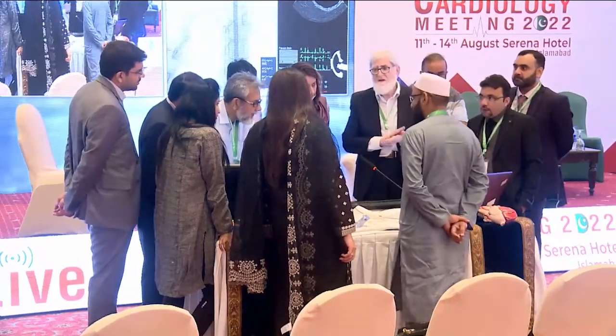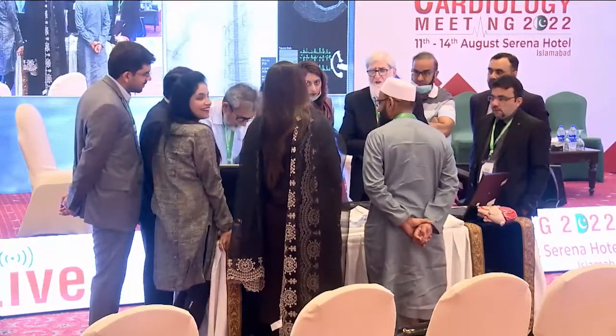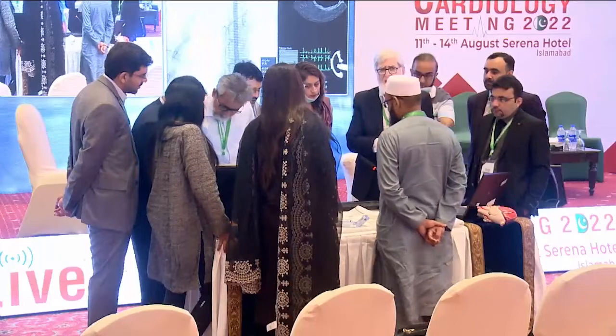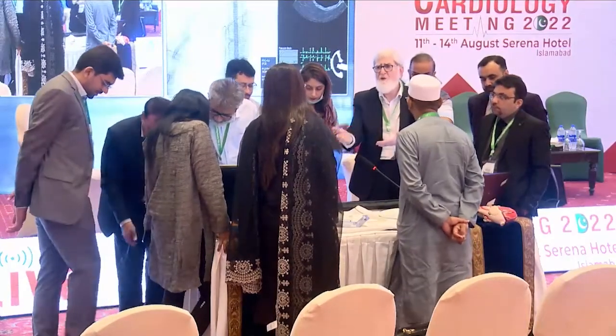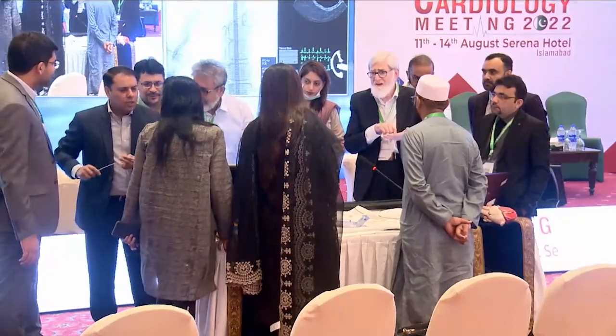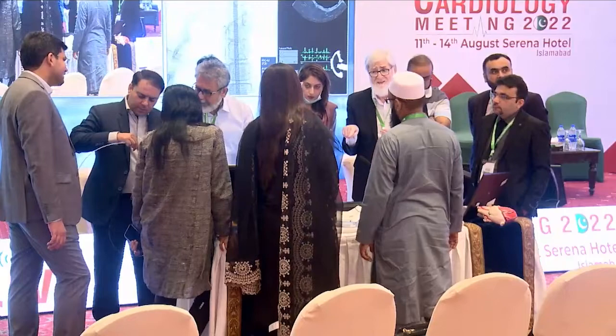It doesn't matter if you want to be in the SVC or go to the innominate. I personally would prefer to go into the innominate. That will tell me that the innominate vein is right there and the coronary sinus will not be dilated. Are you getting my point?